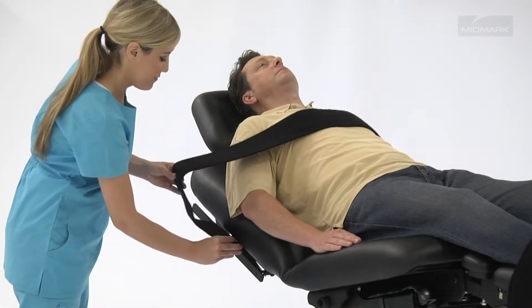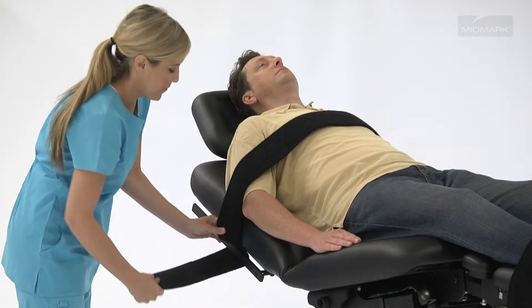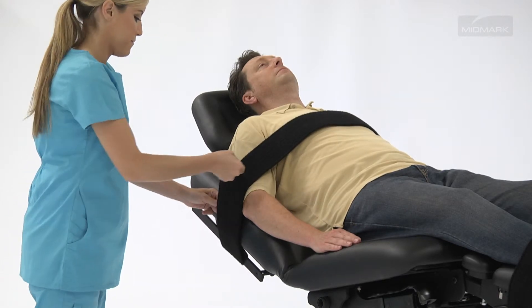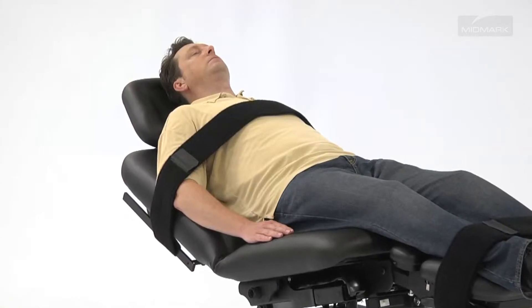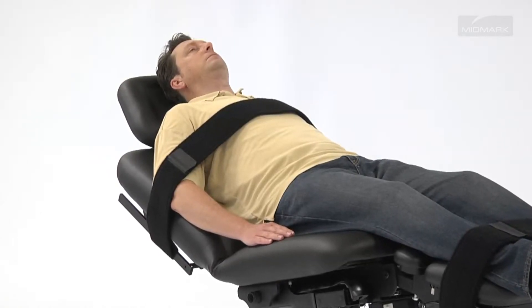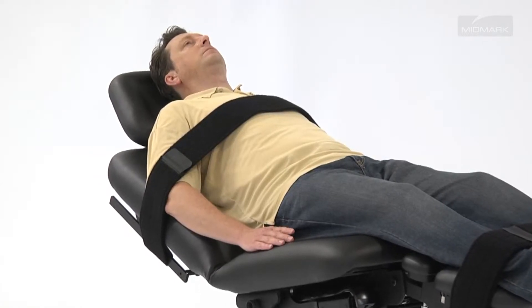Security Straps for the RIDDER 230 are designed to improve patient safety by securing the patient to the chair before, during, and after procedures. Security Straps come in a set and are situated at the patient's chest and legs during use. Their width and location are adjustable, accommodating most patients' physical needs.